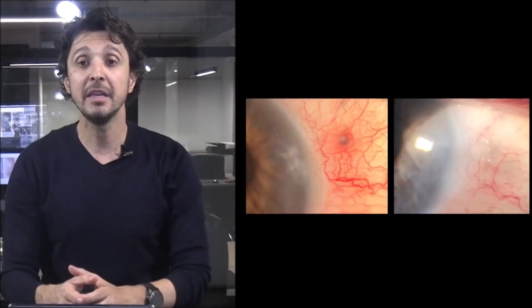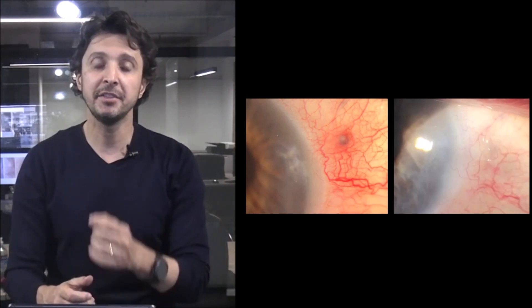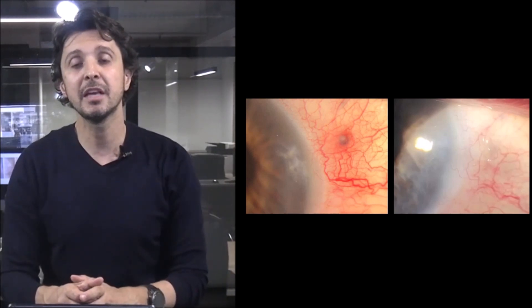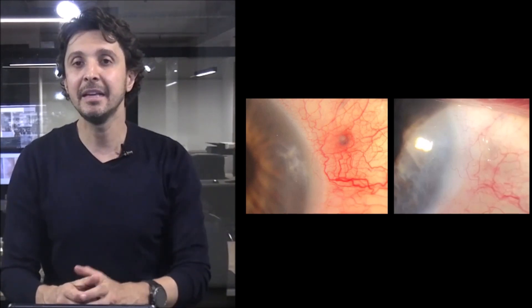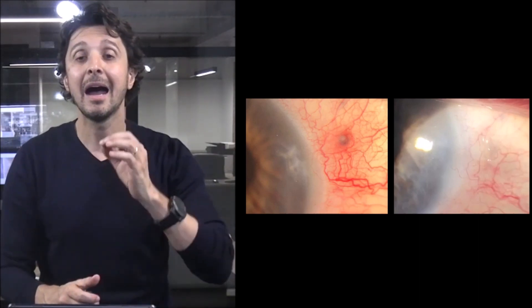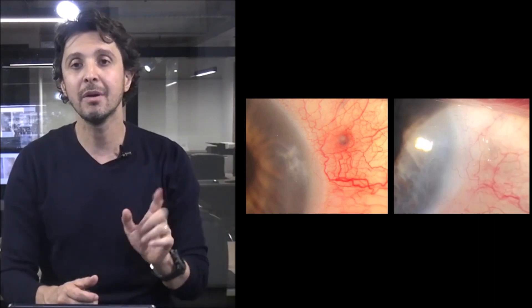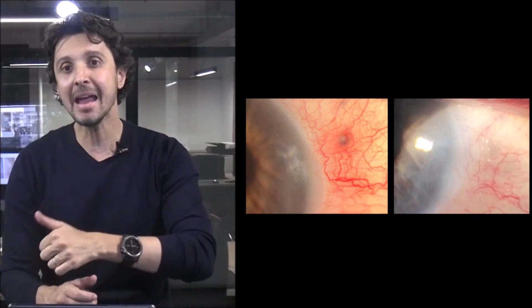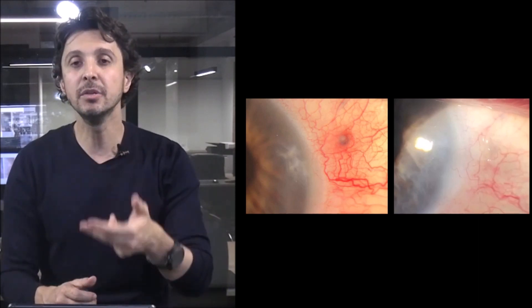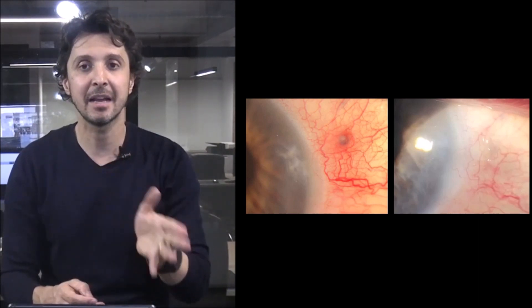These two images show a patient I published in the JCRS where you can see some conjunctival inflammation, which I treated with moxifloxacin and corticoid for seven days. After that I returned to the operating room, reduced the size of the flange, and placed it back inside the scleral tunnel.